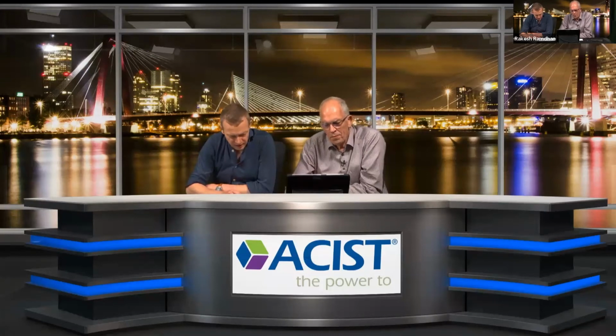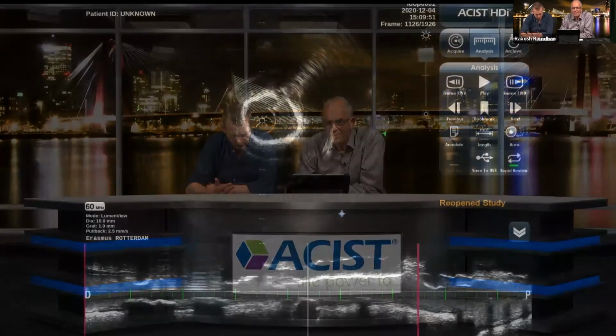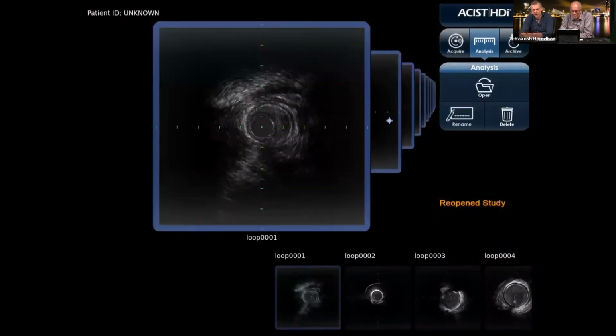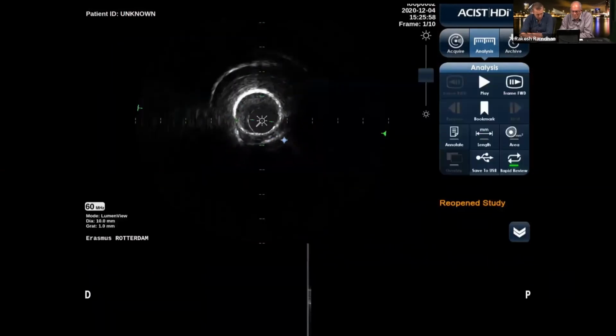That in this case was not the case, and also with a 33 stent, only the mid part of the lesion was covered. And that's quite interesting. So the operator was quite confident. The balloon expanded nicely, stenting, post-dilatation with a 3.5 NC balloon, and then repeated the IVUS. And that's the next pullback we want to show you.